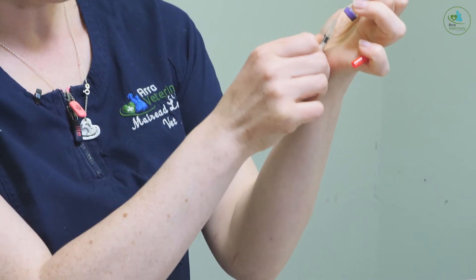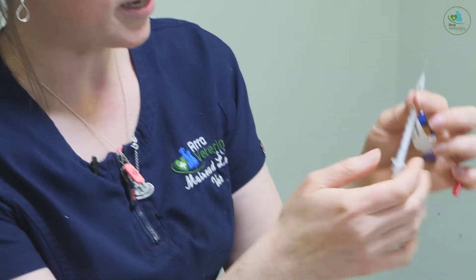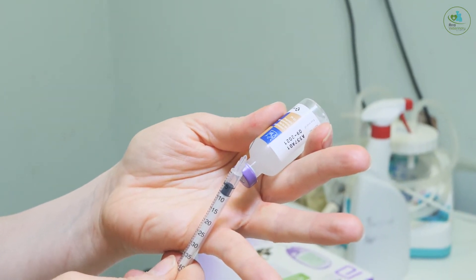Then you place your syringe into the bottle and draw back slowly. Ruby is on five units of insulin here. You can see that the needle is extremely fine.